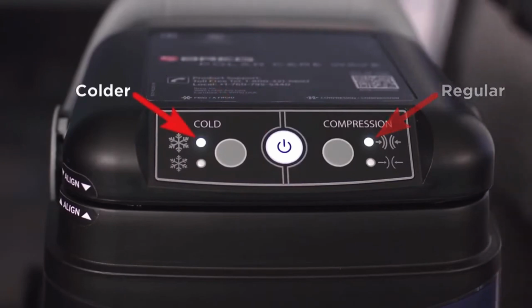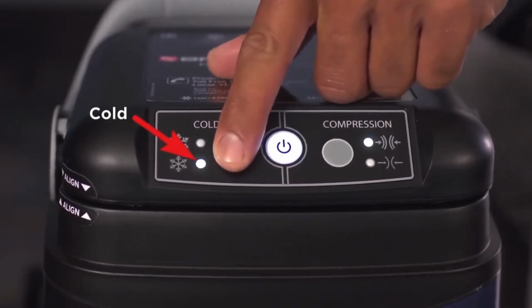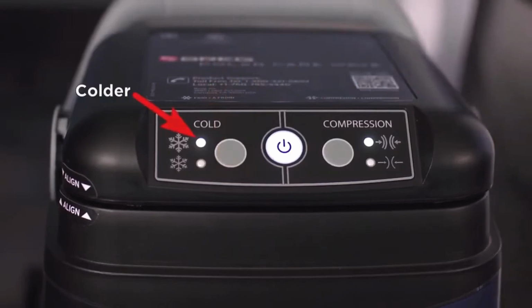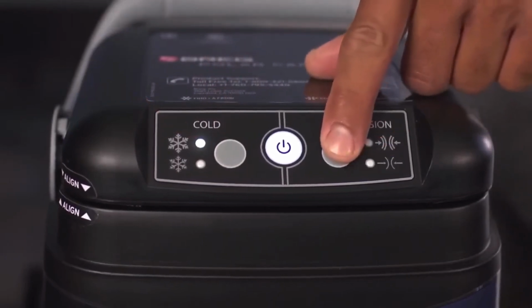To change cold settings, press the cold button to cycle between colder, cold, and off. Press once more to return to the colder setting. To change the compression settings, press the compression button to cycle between regular, low, and off.